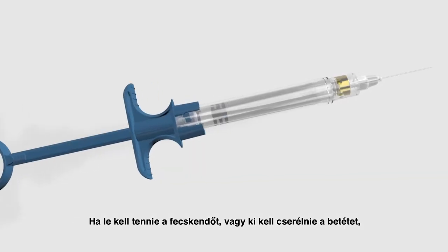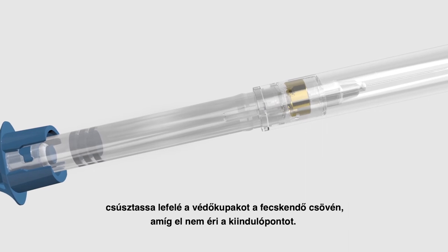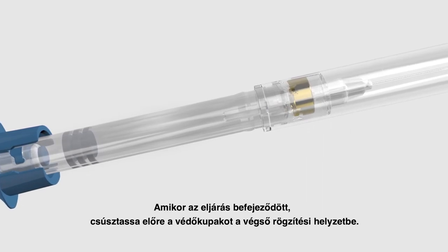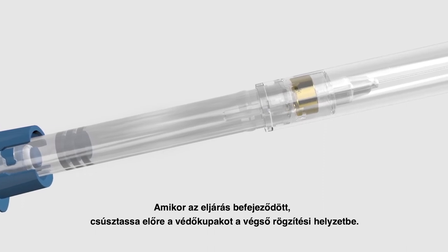If you need to set the syringe down or change the cartridge, slide the protective sheath down the barrel of the syringe until you reach the first holding position. When your procedure is over, slide the protective sheath forward into the final locking position.